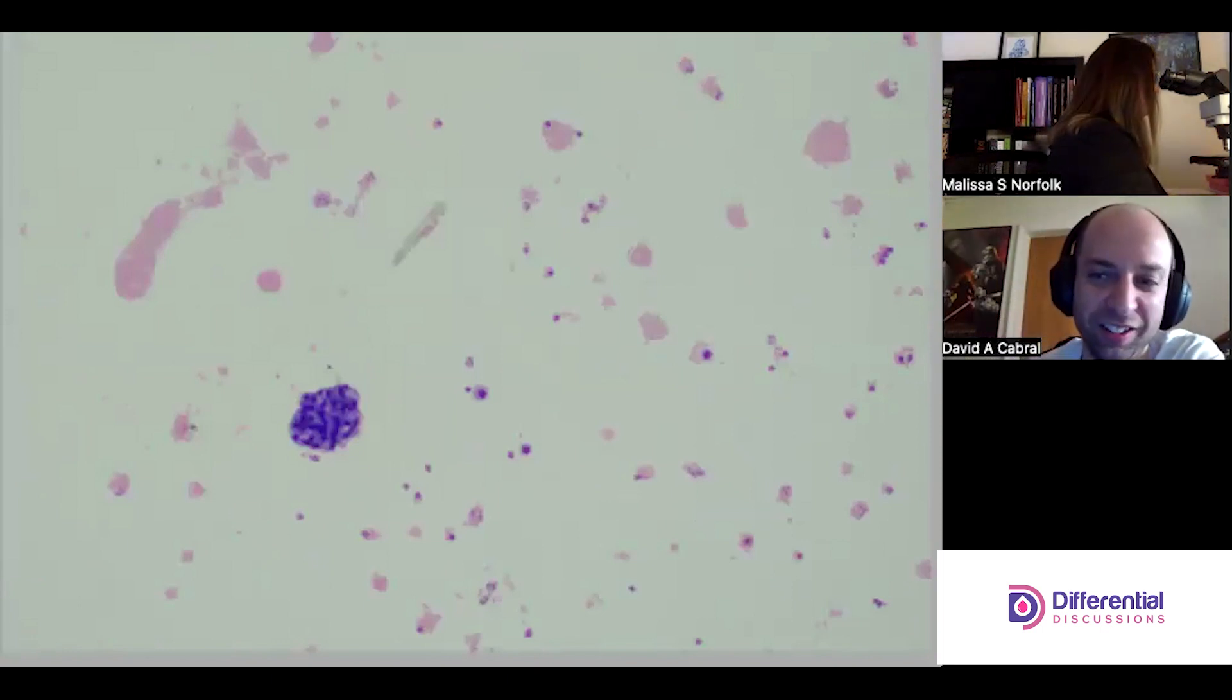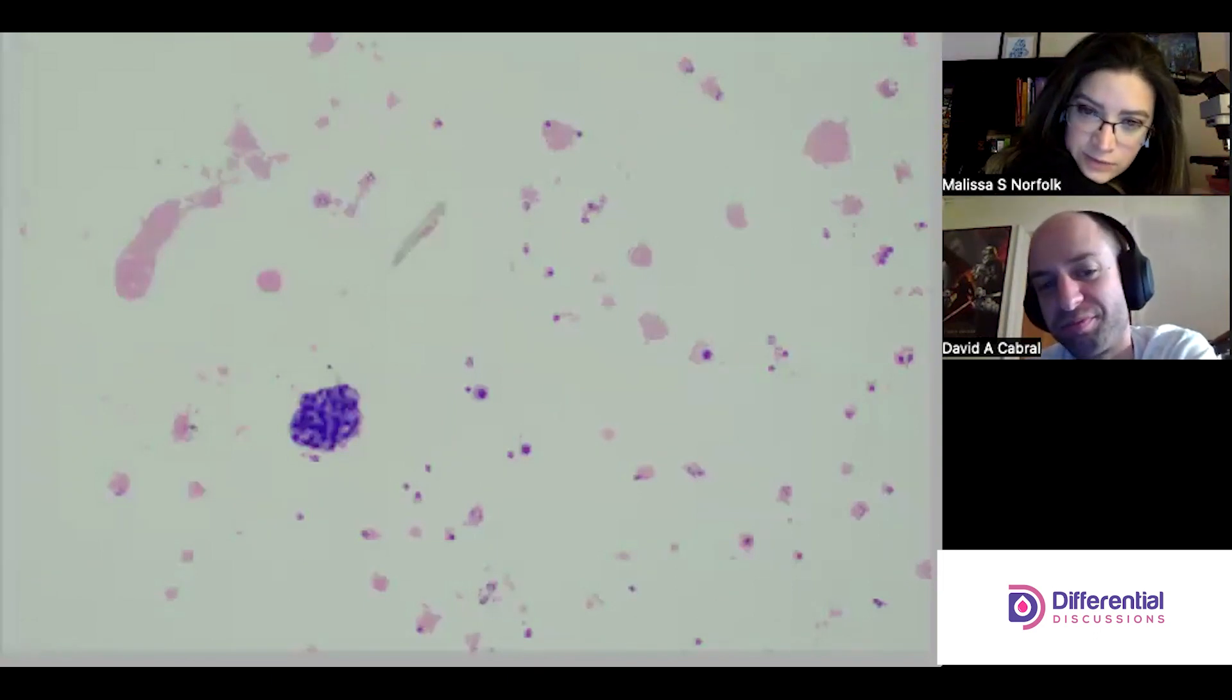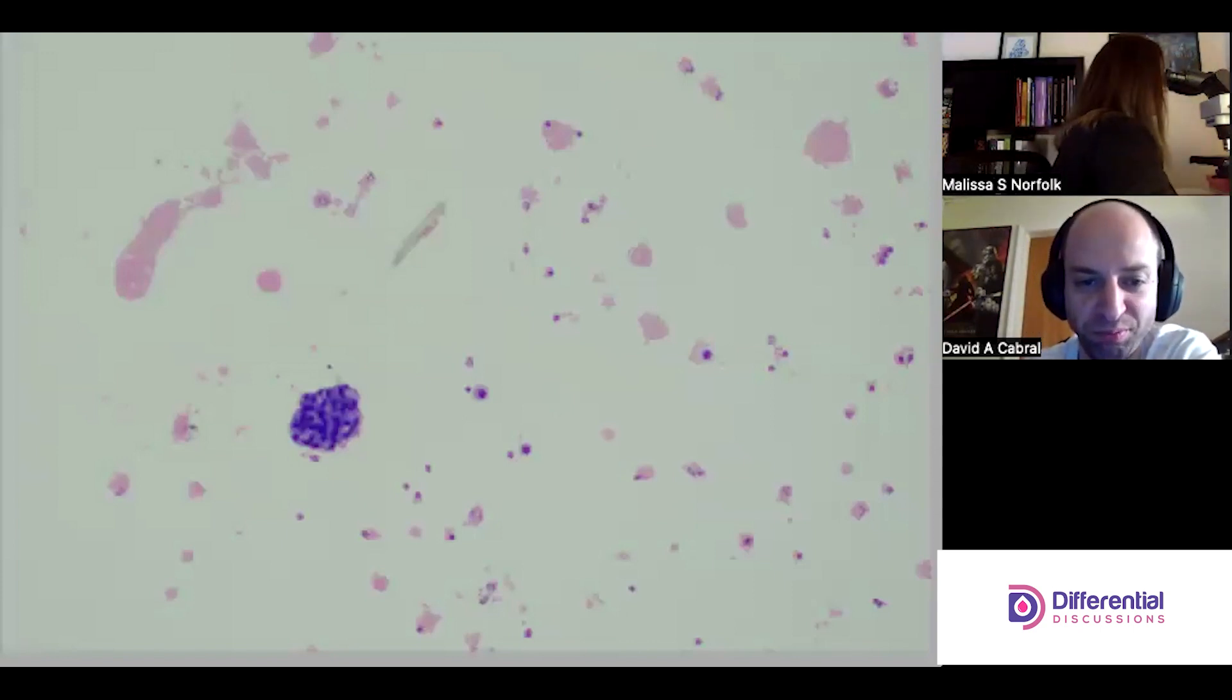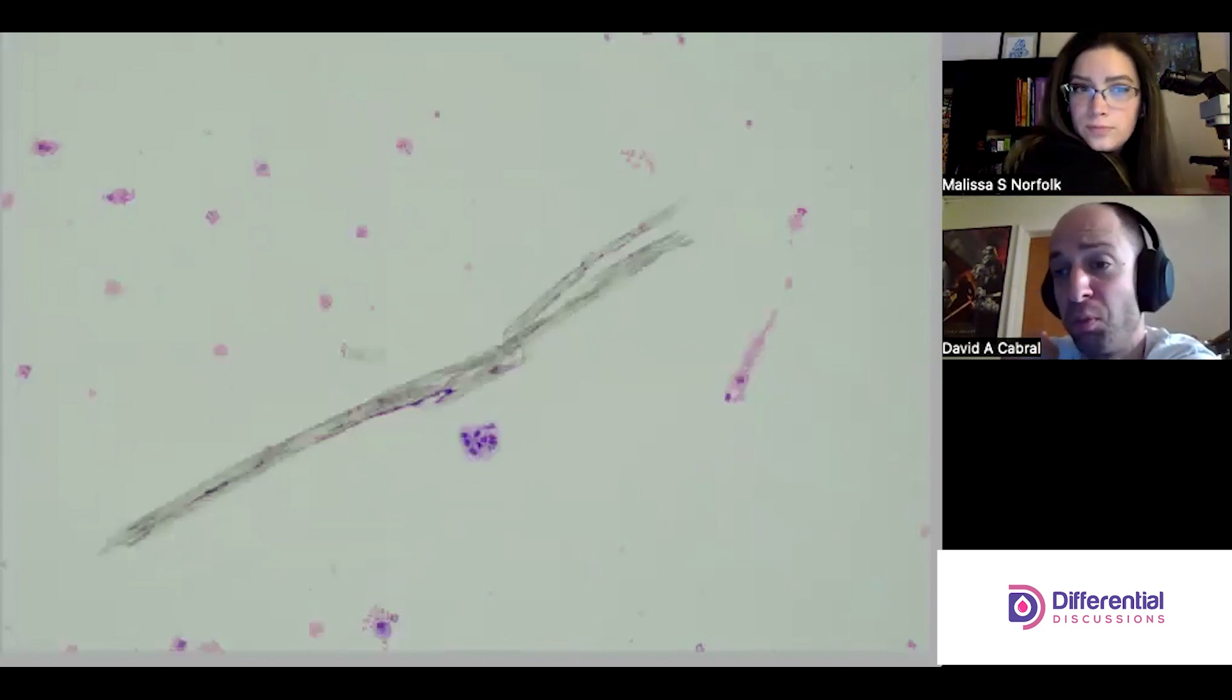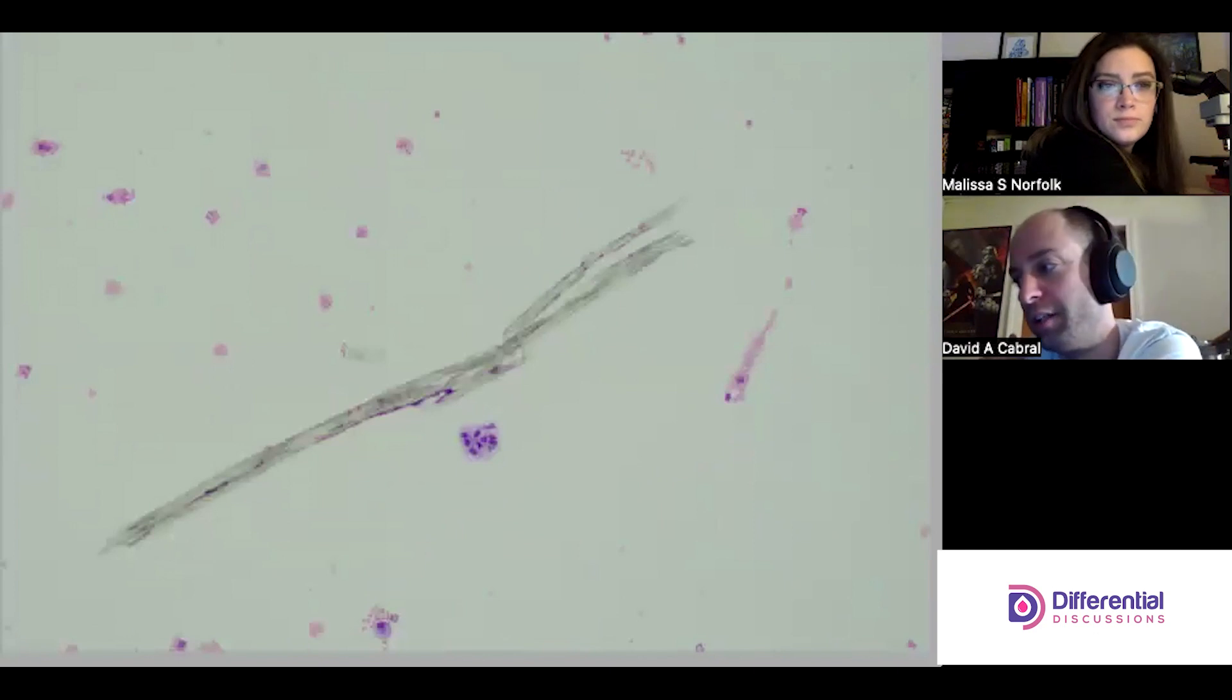So look at that. Follow something, follow something indeed. It still doesn't really look 3D from up here, but we'll see. We'll keep scanning. This is the end of this row. Oh there's another clump. So Melissa talked about 3D. One of the ways that you can kind of tell that it might have some depth to it is it'll be really dark in coloration. So you get darker spots and as the light path has to pass through more cells, more stuff, you get that really deep dark kind of coloration.